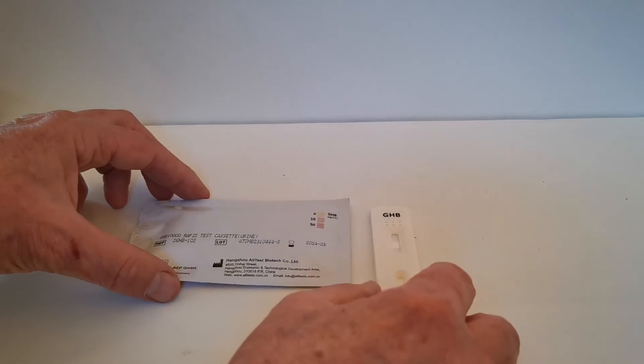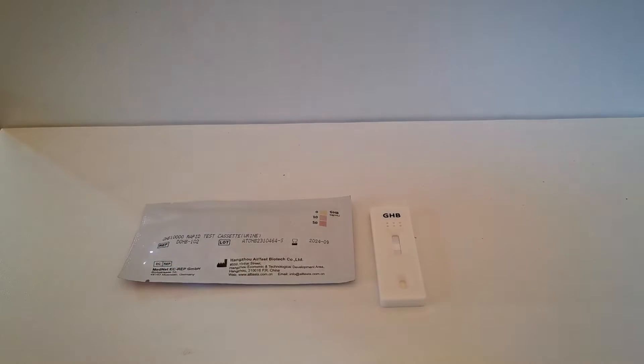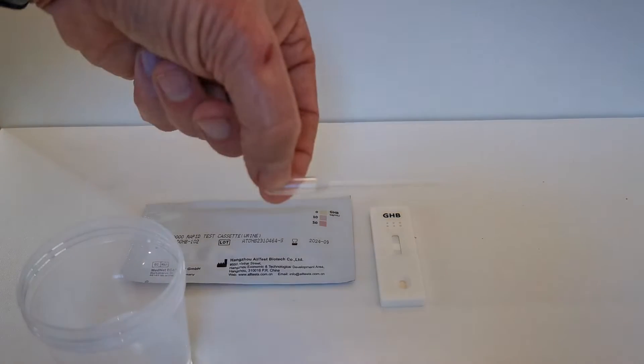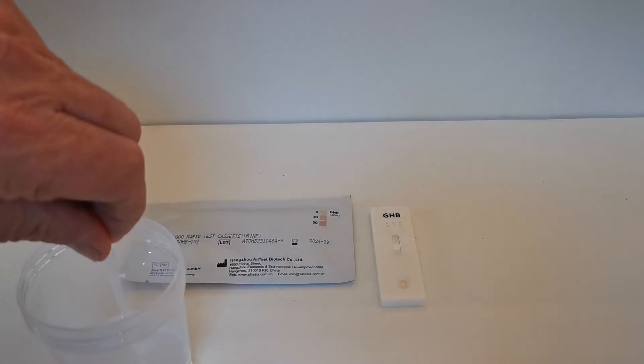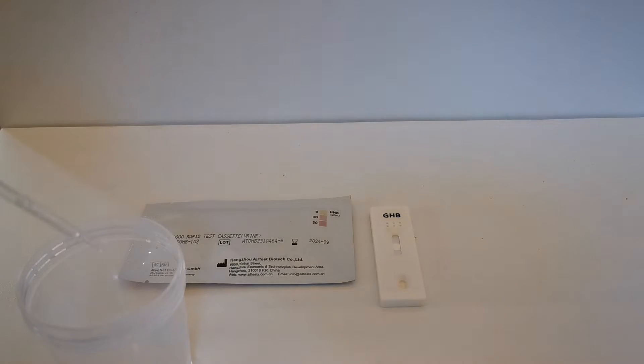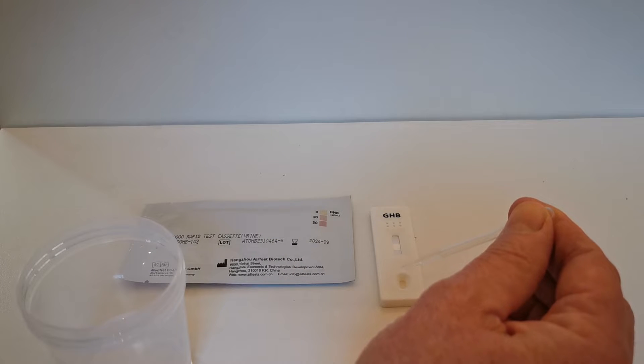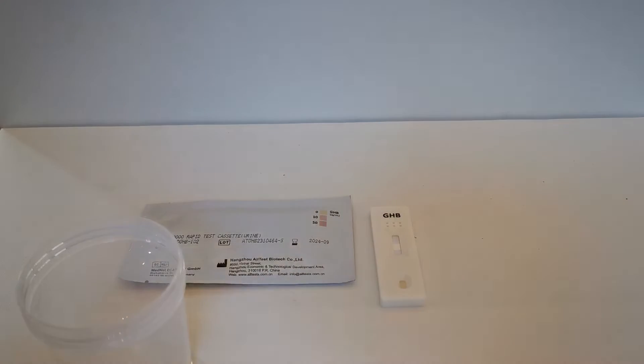To run a test, remove the test cassette from the foil just before you are ready to perform the test. Using the pipette supplied with the test kit, take three drops of your sample and place it into the sample well. Now the test will take approximately five to ten minutes to run.